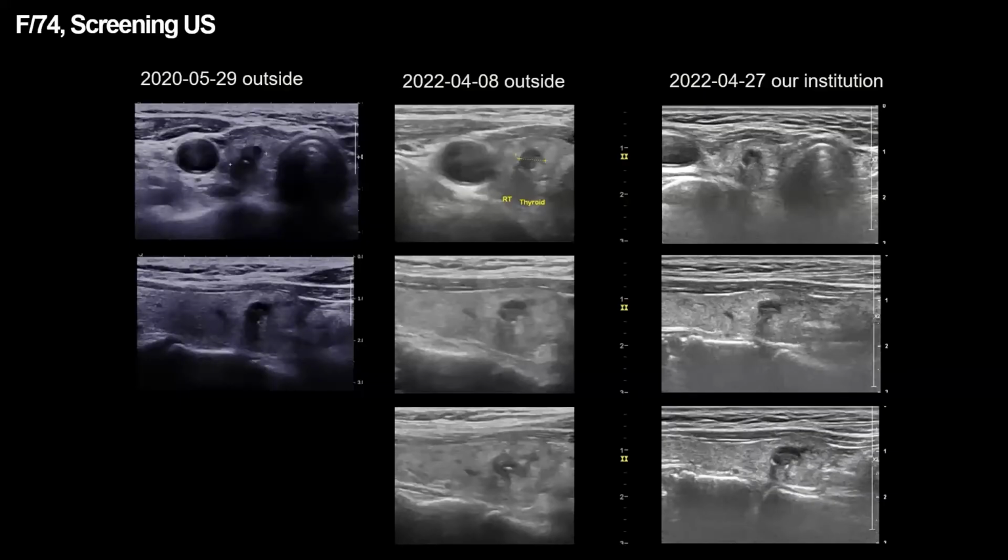This 74-year-old woman visited our hospital to undergo FNA after suspicious ultrasound features were observed on a screening ultrasound performed at an outside clinic. The patient also brought ultrasound images taken 2 years before. When we compare nodule size between the two outside images, we can see that there were different interpretations about nodule margin.